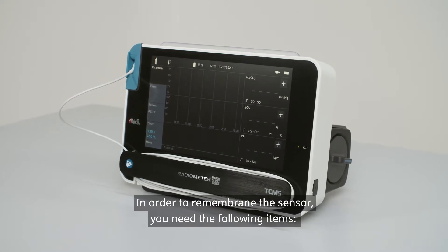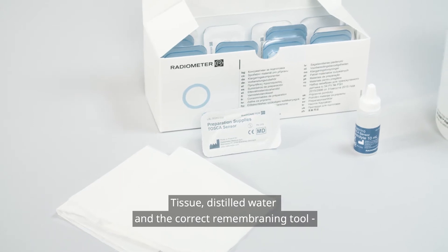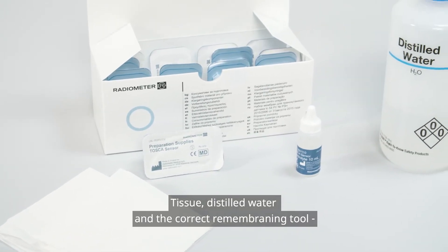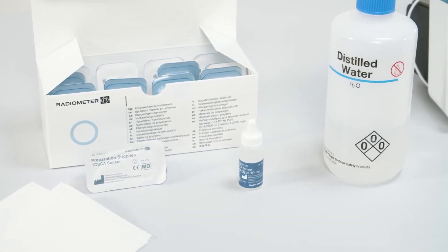In order to re-membrane the sensor, you need the following items: tissue, distilled water, and the correct re-membraning tool and corresponding electrolyte for the sensor being used.